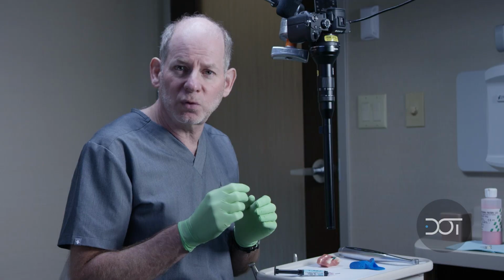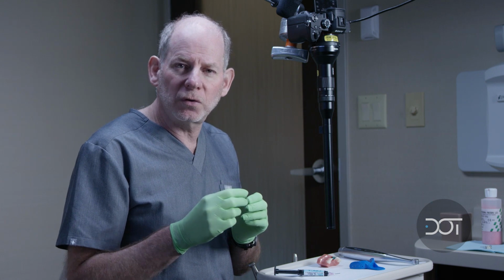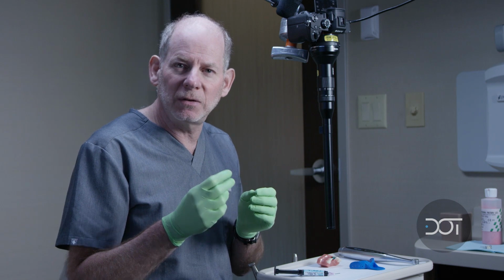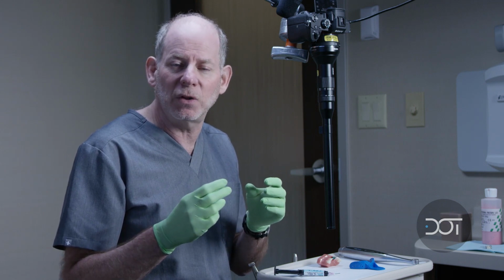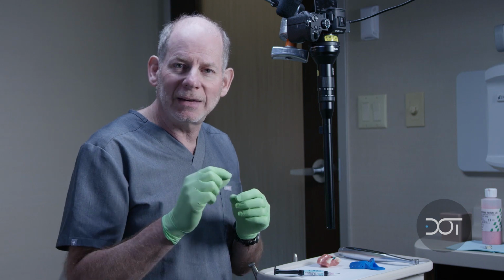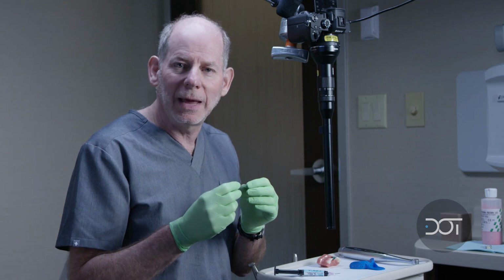I'm going to use it over the screw pin, and I'm going to do it for two reasons. Number one, with this material over the screw pin head, it makes it much easier when I'm seating the impression tray, because this gives a little bit more height to that screw pin and then it'll sort of pop through the tray a little bit easier for me to identify it as I'm moving the tray into the mouth. Secondly, once I have this through the tray in the mouth and the pin is popping through, I can take off this flexible composite and I'll have a very clean screw head that's easier for me to unscrew when I go to take out the impression. So let me show you how I do that.